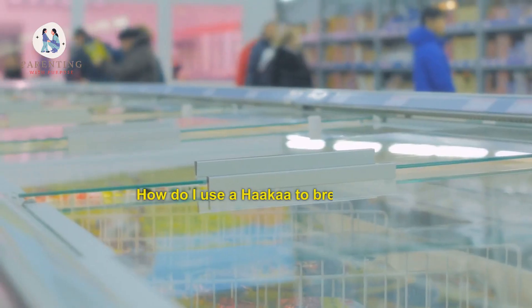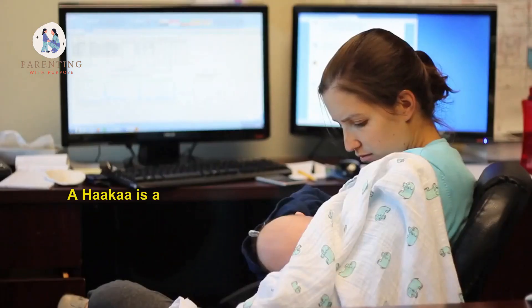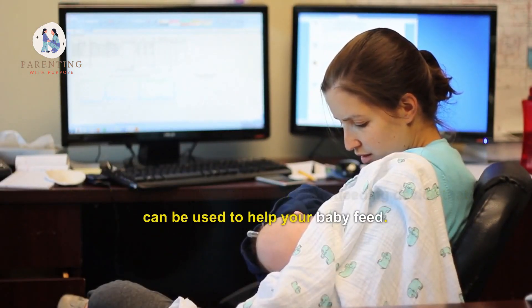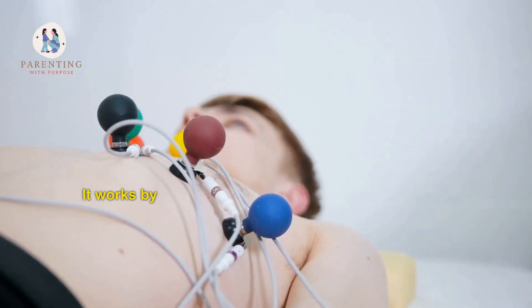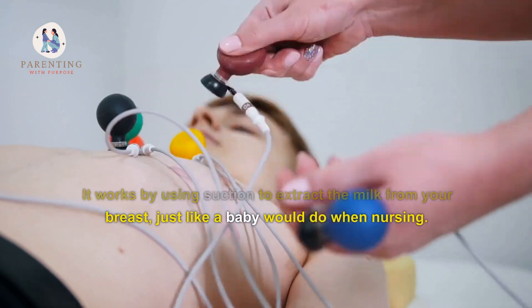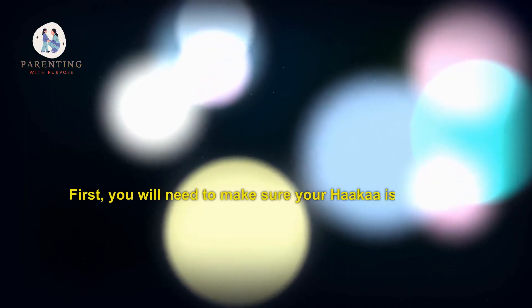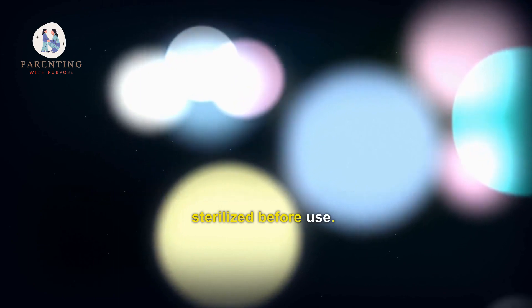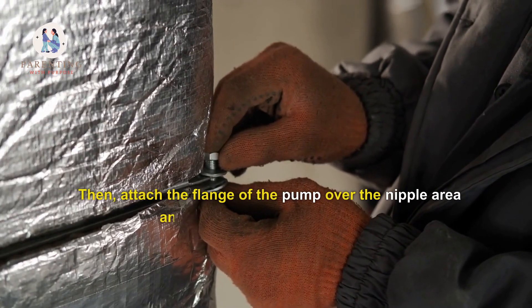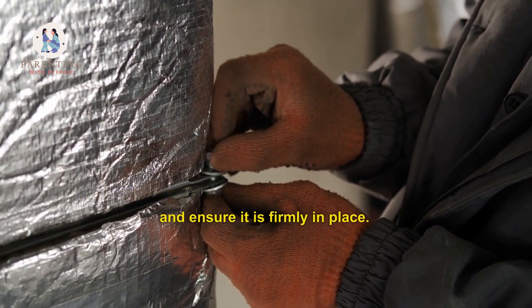A Hakaa is a simple and natural breastfeeding device that can be used to help your baby feed. It works by using suction to extract the milk from your breast, just like a baby would do when nursing. First, you will need to make sure your Hakaa is clean and sterilized before use. Then, attach the flange of the pump over the nipple area and ensure it is firmly in place.